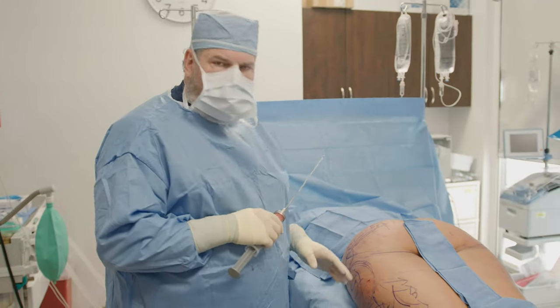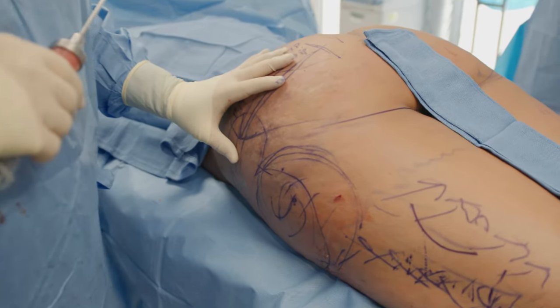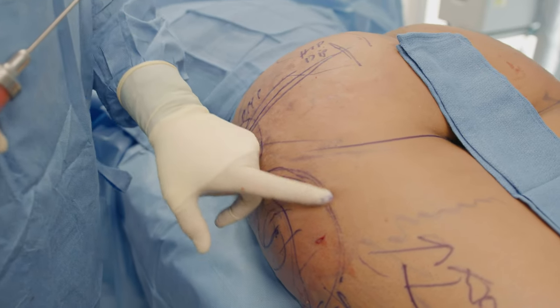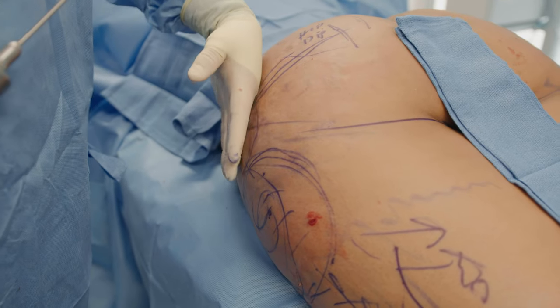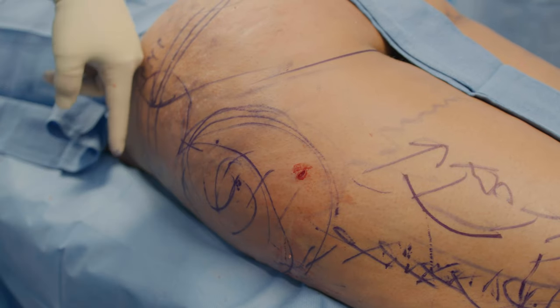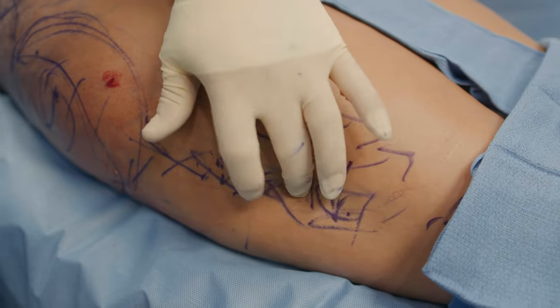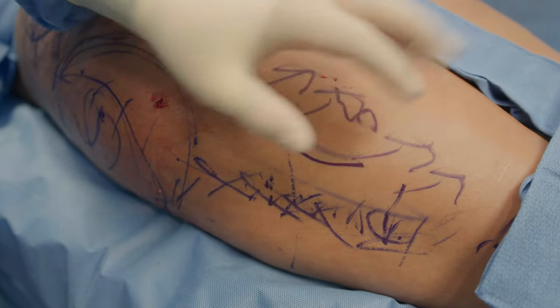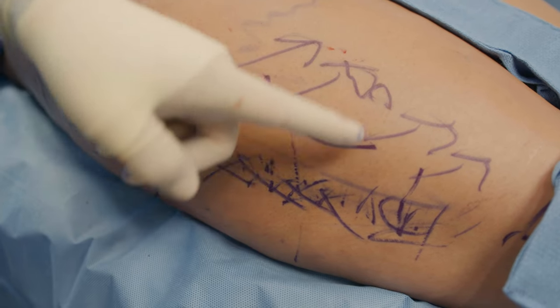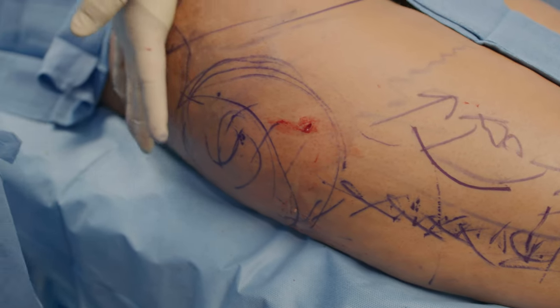I'm mostly done with the hip but I just wanted to show you something at this point. So I built out this point of maximal projection — it's going to come out a little bit more, I'm going to put a little bit more fat here — but I just wanted to pause. So remember I started filling the hip dip here and then walked all the way down here, and now this is filled, this is blended into this — remember this was that fatty deposit — and so that's starting to shape up really nicely. I still have a little bit more fat here for this front hip to place. Now this is starting to get nice and full here, we're getting a nice hip, but I haven't filled anything here in the leg. This is the little tract that I'm going to fill in, which separates the hamstrings on the back from the quadriceps on the front. There's a natural depression here — we're going to fill that in so it's going to be nice and round here — and then once I fill this area, that's going to blend into this fatty deposit so that all of this hip will be that nice convex OG.